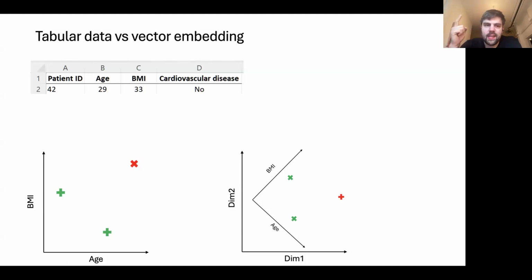So what you're asking is, even if you have a data set of vector embeddings, you might find that different dimensions are highly correlated, but that doesn't mean there is redundancy in the representation. What you're actually interested in is what's called the rank of the matrix. Loosely, if you did PCA, how many dimensions do you actually need to explain virtually all of the variance in your data set? So hopefully that made sense.